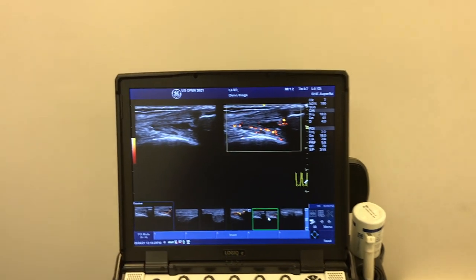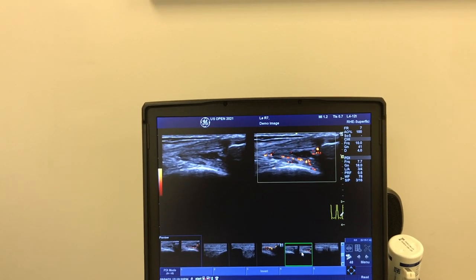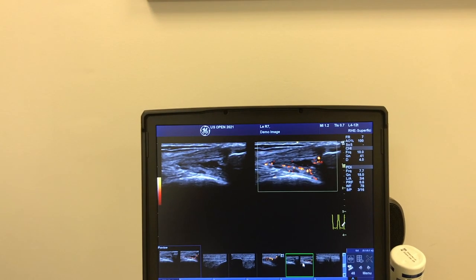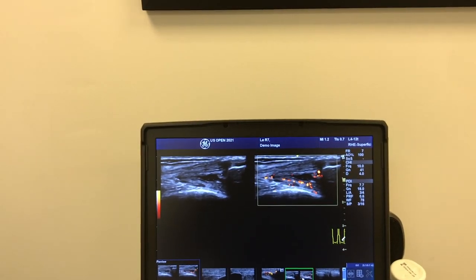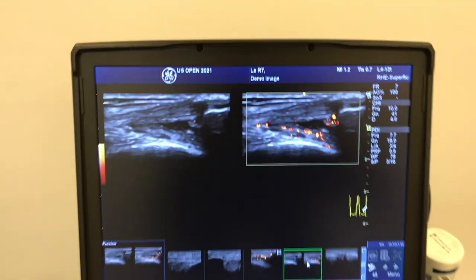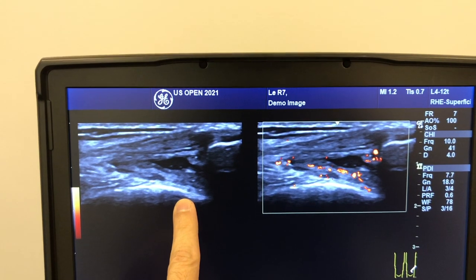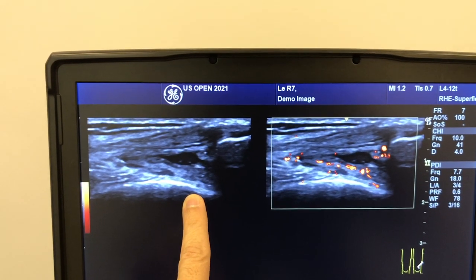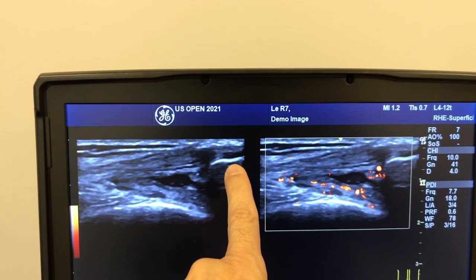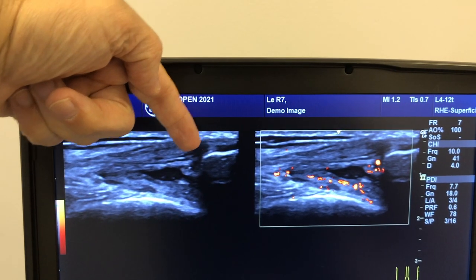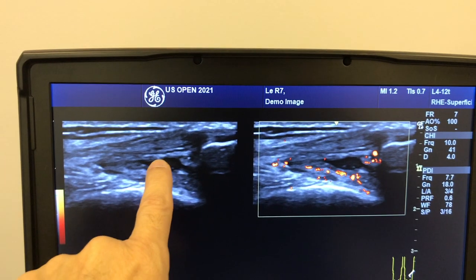Another interesting feature of ultrasound is color and power Doppler. Power Doppler is commonly used to evaluate for areas of soft tissue inflammation or hyperemia. In this example, we have a long view of the suprapatellar recess in the knee. This is the asymptomatic knee — here's the anterior femur, this is the patella. On top we have the quadriceps tendon, and in between we have the suprapatellar recess with a little bit of fluid.